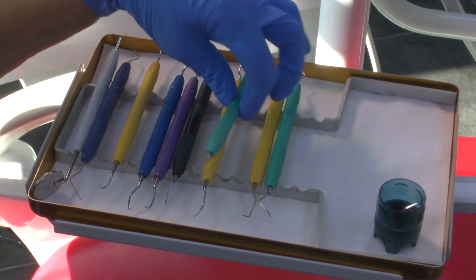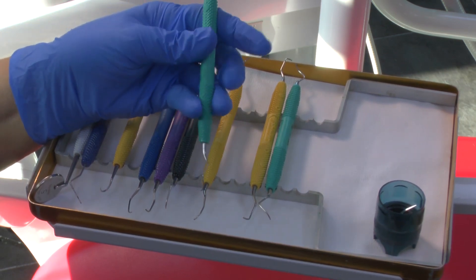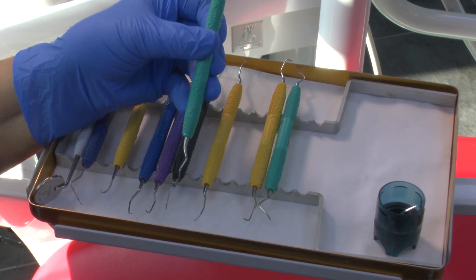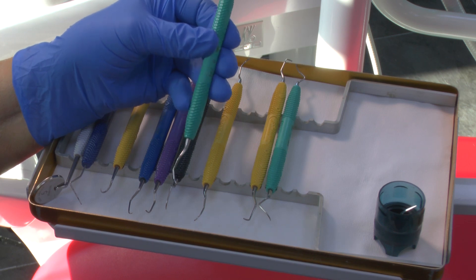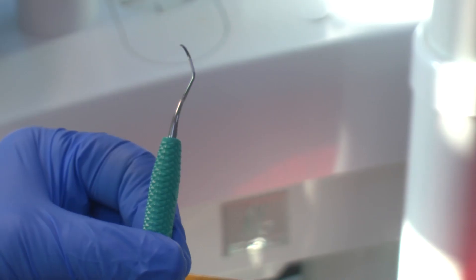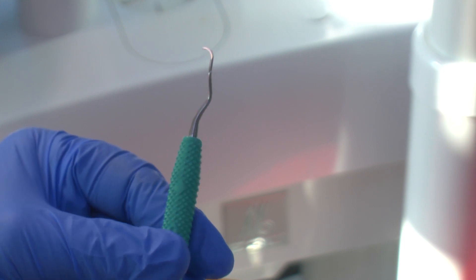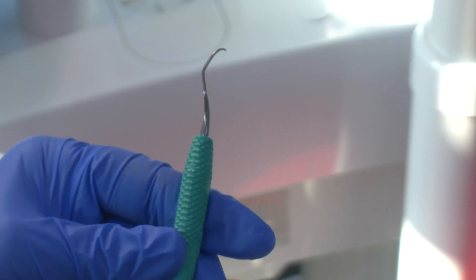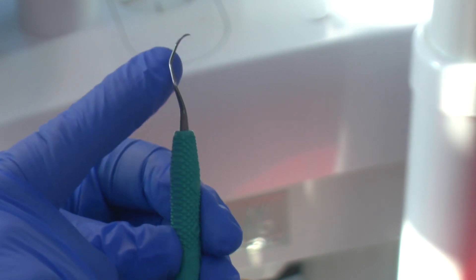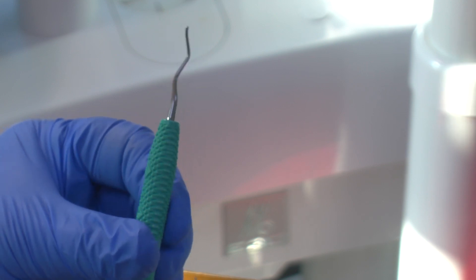The pale green is for distal surfaces. It's a little bit further from the midline of the mouth, but it still has a curve very similar to the instrument for the mesial surfaces. This is a Gracey 13-14 and, like all Graceys, it's sharp on one side and angled so that it makes good contact with the root surface. The curve in the neck helps to get to the premolars and molar areas.